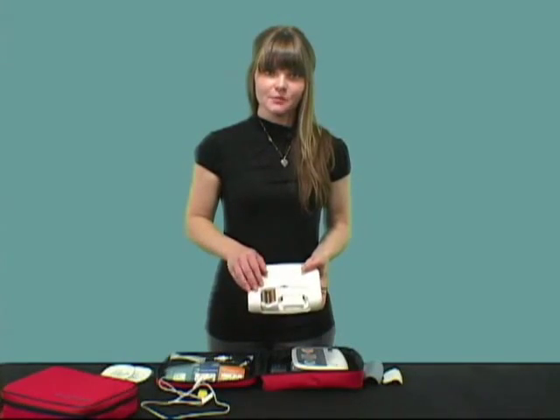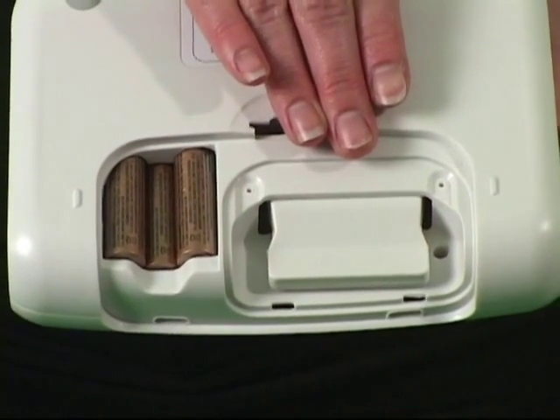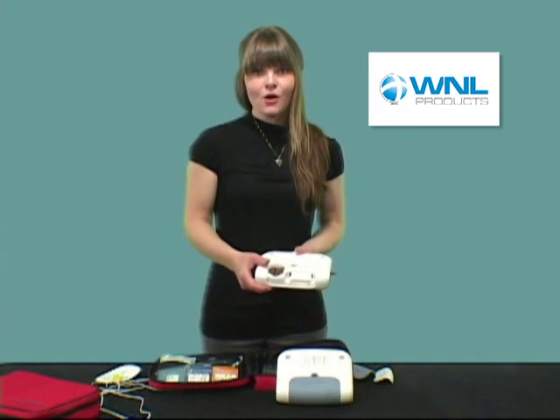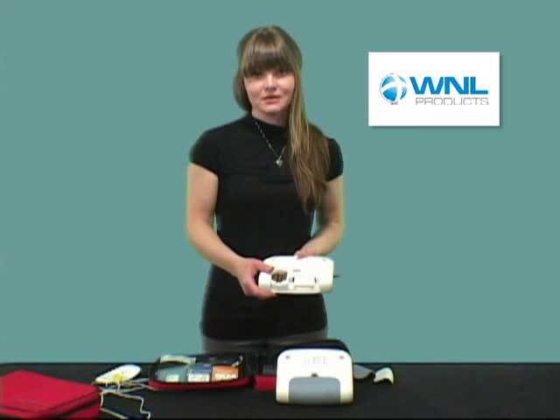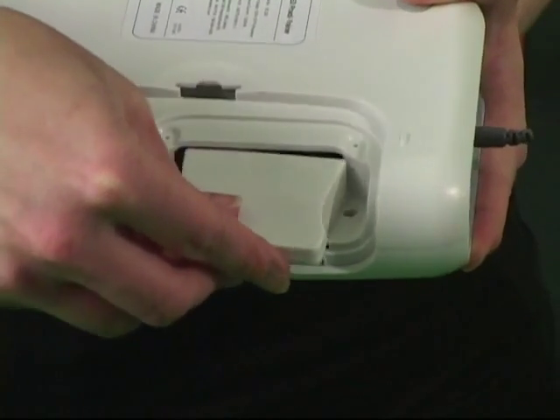On the back is the compartment for the batteries and the language scenario module. The PractiTrainer holds two different languages. Language modules come in many different language combinations. If guidelines change or you want different languages, for a nominal fee, you can purchase a language module and simply replace it in your device.